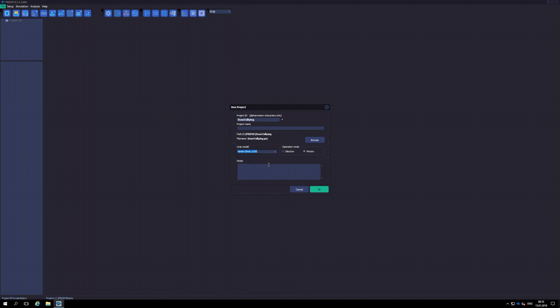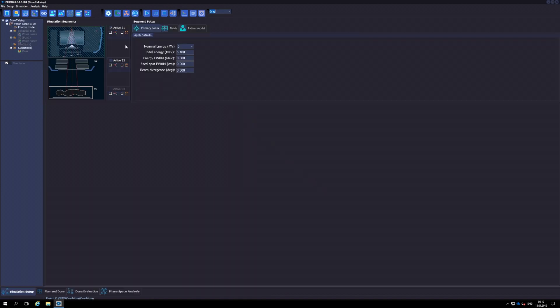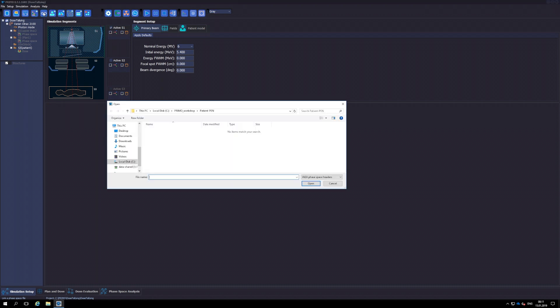Primo does not check that this coincidence occurs. To link a previously tallied phase space file into the current project, it is necessary to click the chain icon. Primo assumes that the linked phase space file belongs to segment 1.